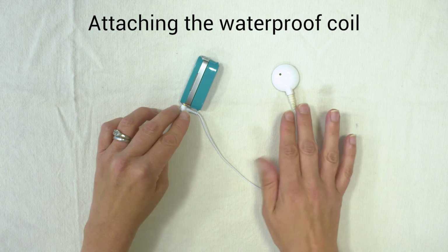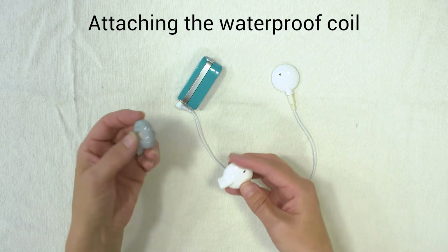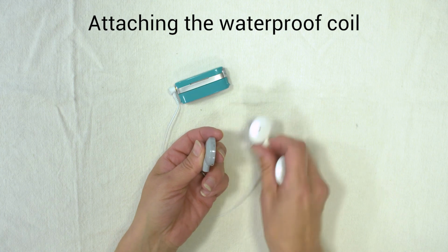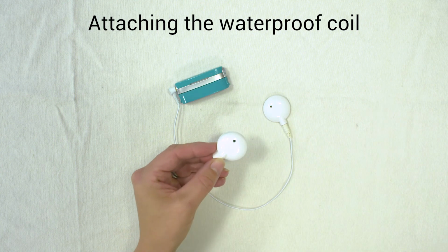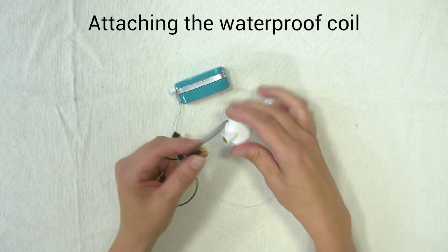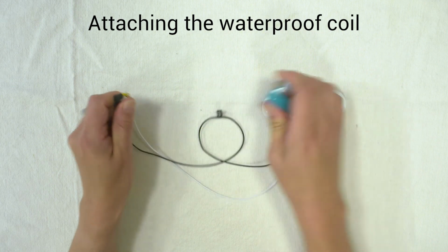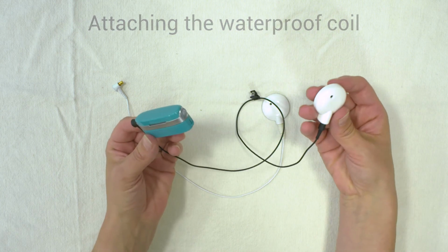There is a specific coil, which you can see is much thicker than the usual coil, with a specific cover, and for the lead, it's a good idea to have a different colour lead that you're going to use as the aqua accessory. Then it attaches in the usual way, and you're ready to go swimming.